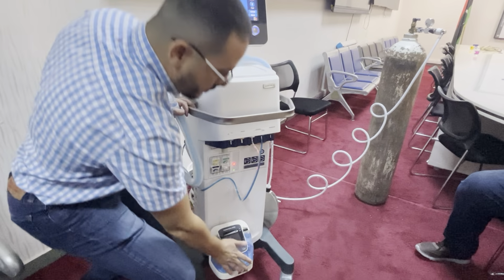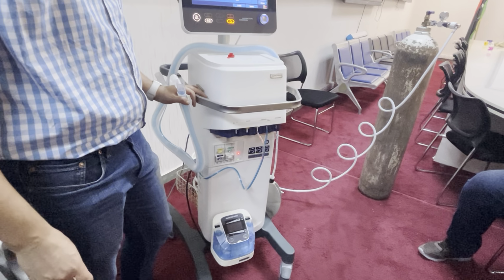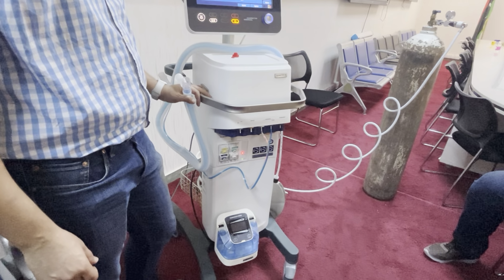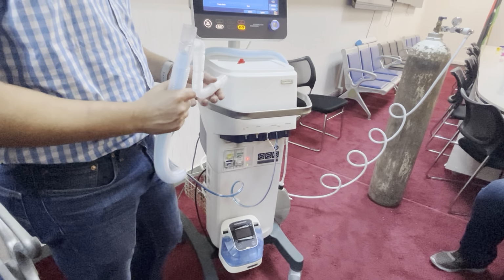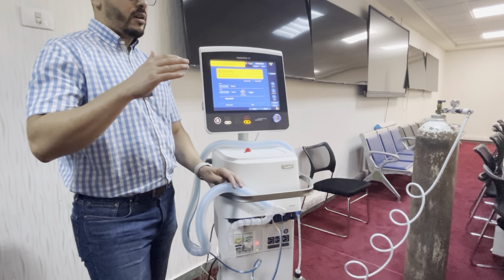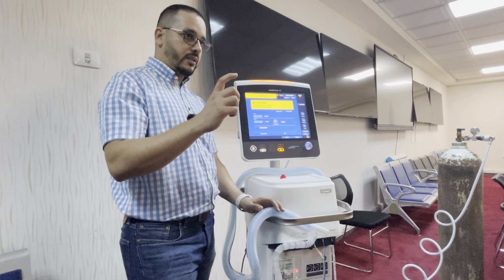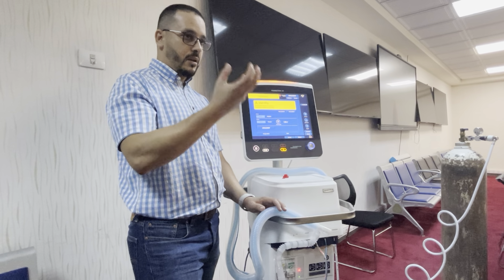Can I ask you regarding the humidifier? You said it needs to be connected for more than 4 hours, but can we not use artificial ventilation without a humidifier and without filters? Yes. So, in case we are using the ventilator for less than 4 hours, we can use a passive humidification system, which is the HME filter. The HME filter is a special filter that has the capability to absorb the moisture coming out from the patient.